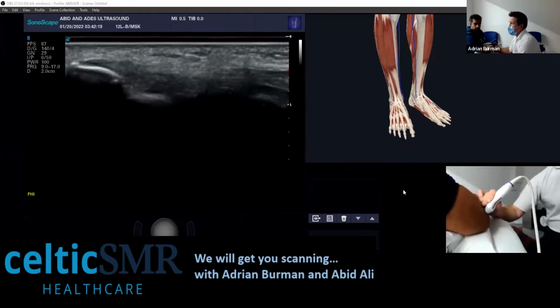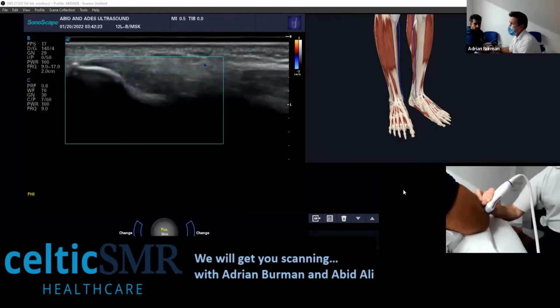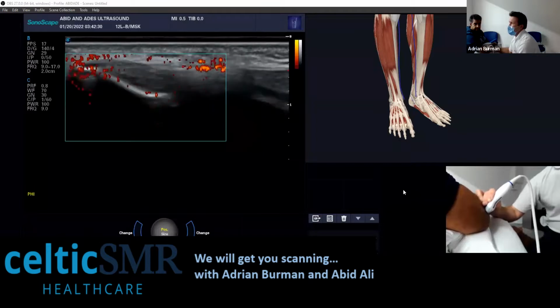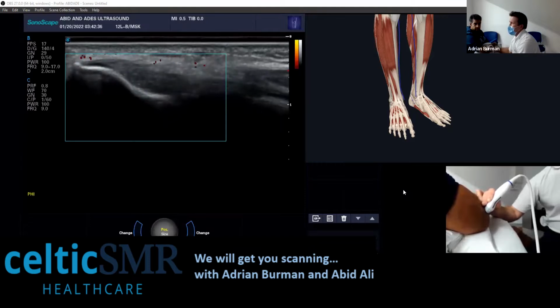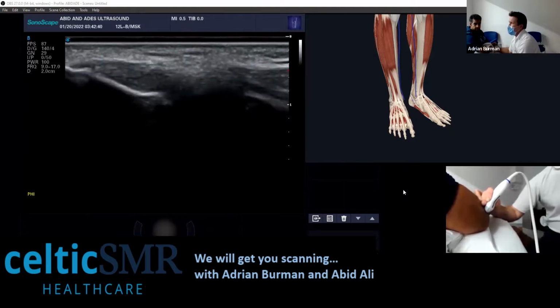And if you put the colour on, I tend to just put that across there. So I'm going to change that to PDI and just basically interrogate that area just there, looking for any tears or any flow within that there. And that should be pretty much on the ECRB.